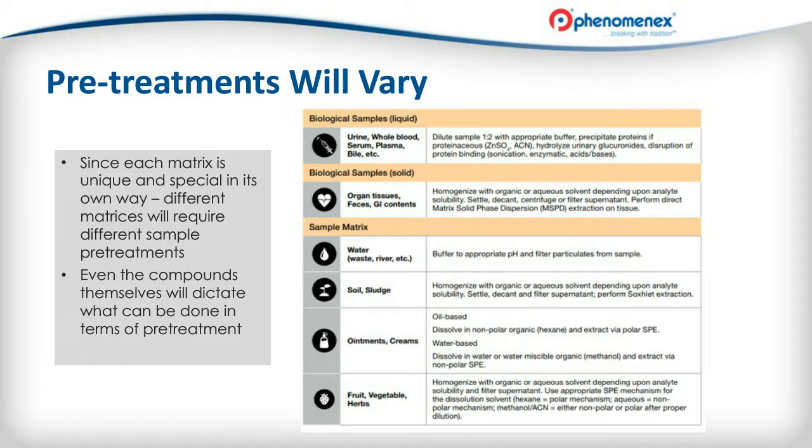So this is usually performed, well, historically, via base hydrolysis, acid hydrolysis, or I guess now sort of the gold standard is with enzyme hydrolysis, so with a beta-glucuronidase, for example. And then just to wrap things up on this slide, whole blood is also important to pre-treat effectively in that it is different from the previously mentioned biological matrices in that we have to lyse the red blood cells, right? So we can do this either via chemical lysis, whether it's zinc sulfate or with a portion of water and simply performing an osmotic breakdown, typically coupled with some type of physical denaturing.